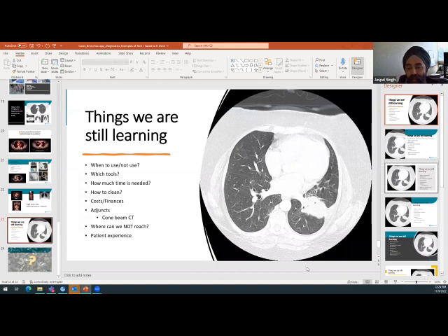All right. Things we are learning and still learning. When to use these technologies, when not to use, how good are they? Which tools, how much time is needed, how to clean these. It adds a whole level of costs and finances, and we don't get paid extra. In fact, it's actually financially hurtful for me to do all these procedures, to be honest with you. It costs me more time, it costs me more money, which is an issue because a lot of pulmonologists don't want to learn these technologies because they're like, why would you learn that? It makes no financial sense for you. So we need payment reform. We need mechanisms to get that better.